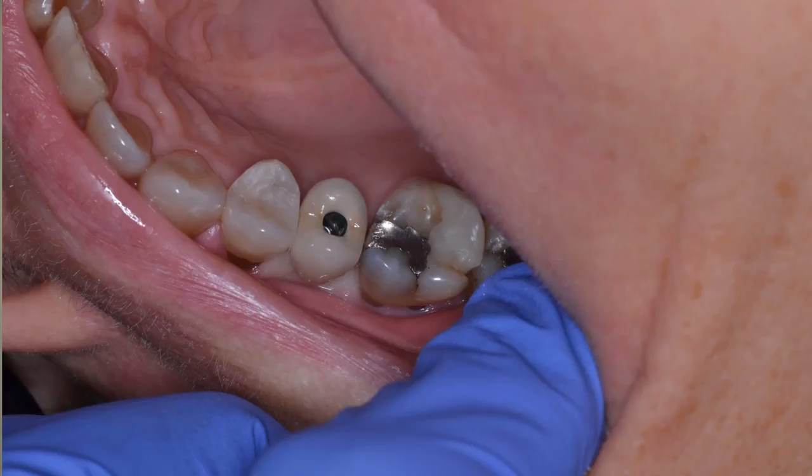First thing you do is check your contacts to make sure they are not too heavy. In an implant dentist, you want very passive contacts. You want a very passive fit because this is a screw retained crown. So you can basically assess this using two methods.